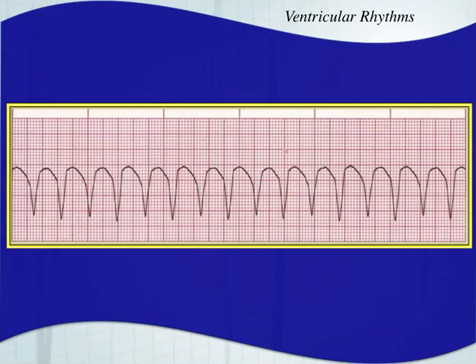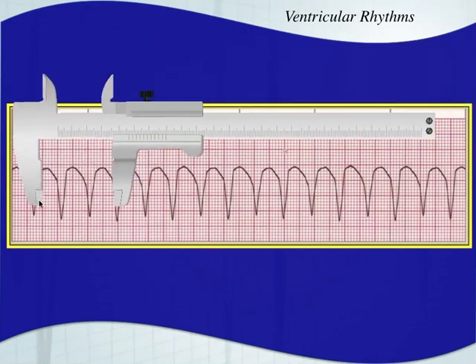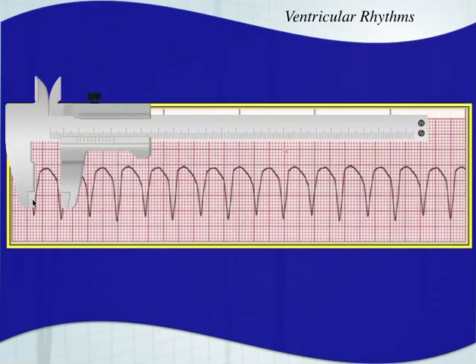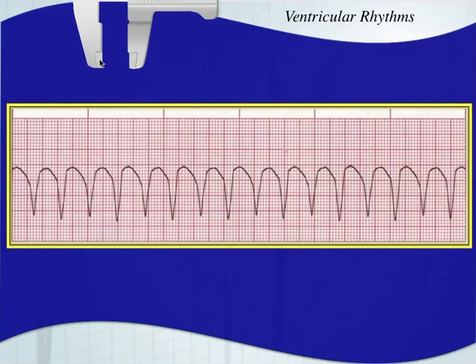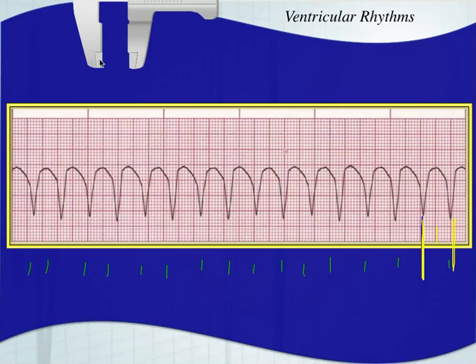Looking at this EKG strip, we have a wide QRS complex that's very regular. The rate — let's count them out — is about 160 beats per minute. Using the big box rule, measuring from one QRS complex to the next, it's almost two big boxes in between, which would be about 150 beats per minute — a pretty accurate estimate. It's faster than 100 beats per minute, it's a wide complex, it's very regular, and we don't really see any P waves anywhere. This is monomorphic VTAC.